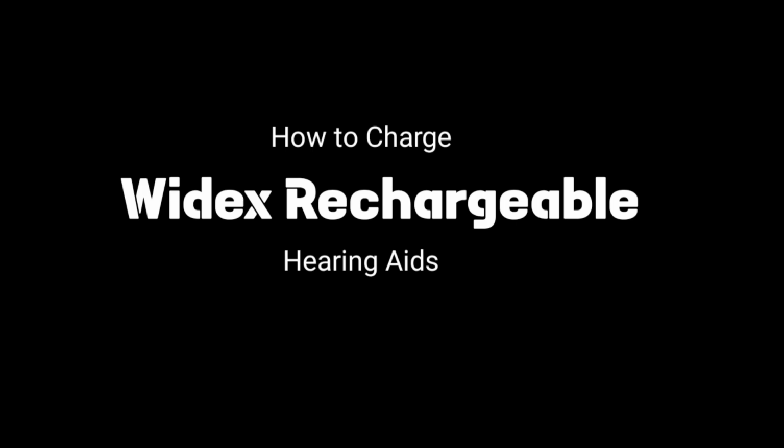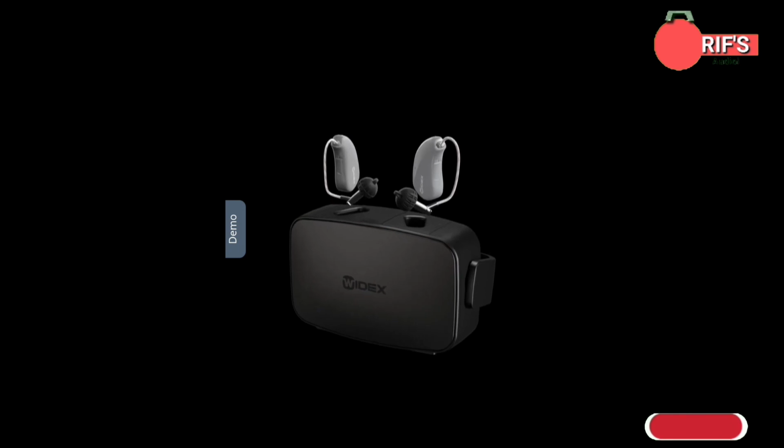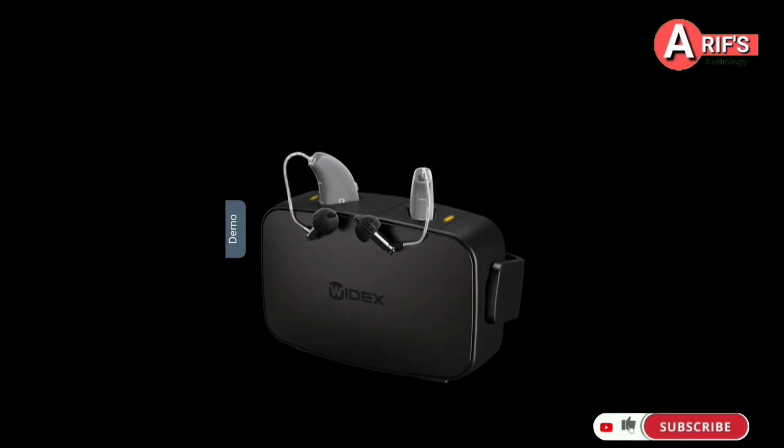Hello friends, in this video I'm going to discuss how to charge Widex rechargeable hearing aids. So you'll be getting two hearing aids with the charger.